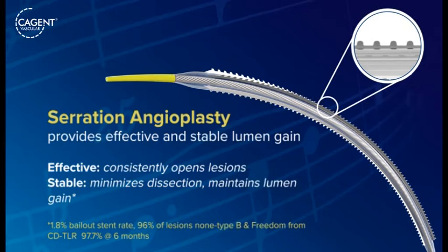And if you think about serrations, I don't know if you still own a checkbook, but if you ever did, every checkbook has serrations in it, so you can get the check out cleanly. Every yellow pad has serrations on it. Every FedEx box that you open, every box of crackers, they all have serrations. And there's a reason they have serrations. They want you to be able to direct your energy along a specific plane, along a specific line, so that that energy can be well used, and it's not just distributed in random fashion across the structure, in this case across the blood vessel. So the potential for a different mechanism of action than balloon angioplasty is really there.